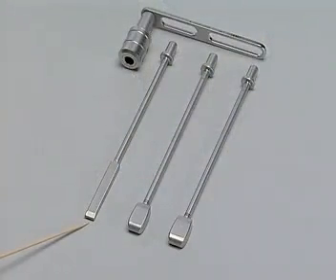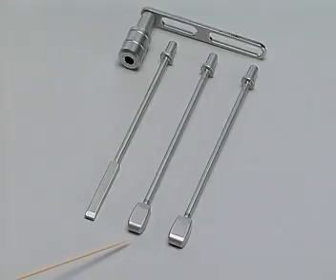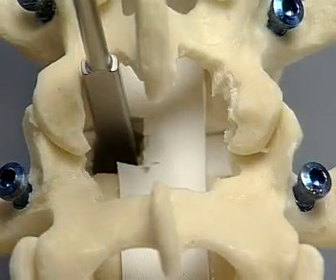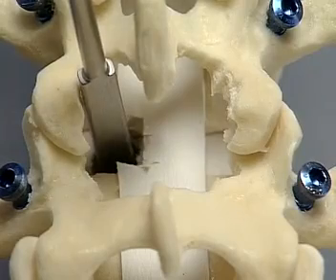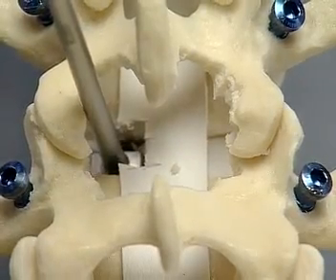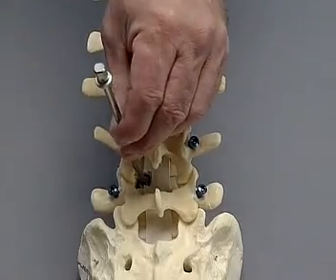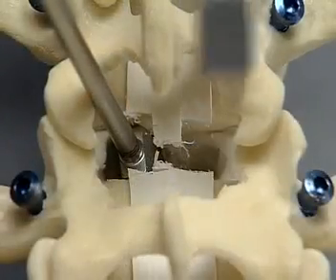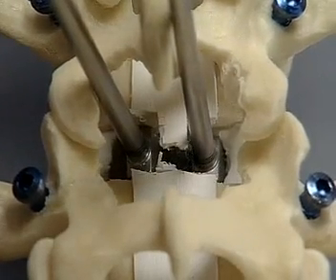To open the disc space, the disc space opener and the vertebral body spreaders are used. The 14 and 15 millimeter spreaders have been chosen for this exercise. The disc space is opened first with a small disc space opener which is rotated to enlarge the intervertebral space. The opener is removed and the smallest vertebral body spreader is inserted until the laser marks on the spreader are flush with the posterior edge of the vertebral body. The spreader is then turned 90 degrees to spread the disc space and the handle is removed. Next, the spreader one size larger is introduced on the other side. Progressively bigger spreaders continue to be inserted from alternate sides until resistance from the remaining annulus is felt.